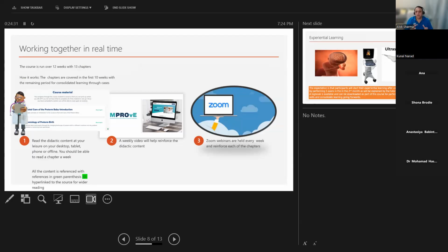To be very honest, the PF can give you slightly better view of the occipital region and the occipital horns, but you get most of that information pretty much by doing the anterior fontanelle if you have a wide open fontanelle. The benefit of using the posterior fontanelle is there if you find that you've got a very small anterior fontanelle and you're struggling to access the posterior part of the brain. In addition to that, we'll also be covering Dopplers.